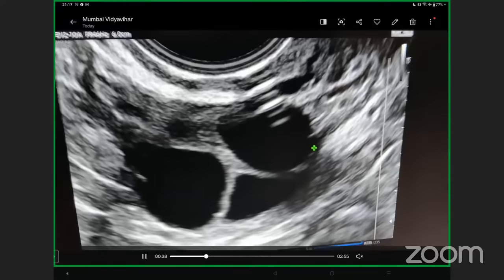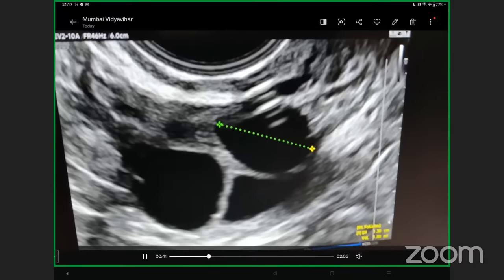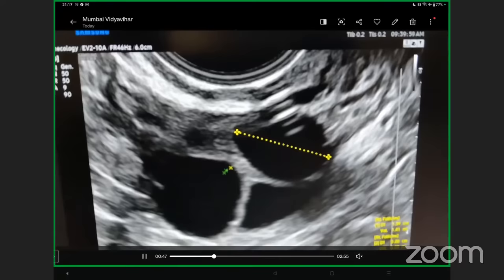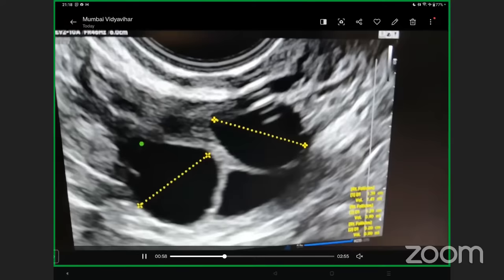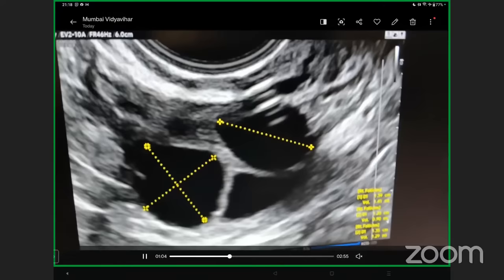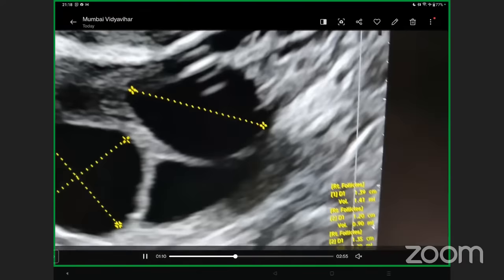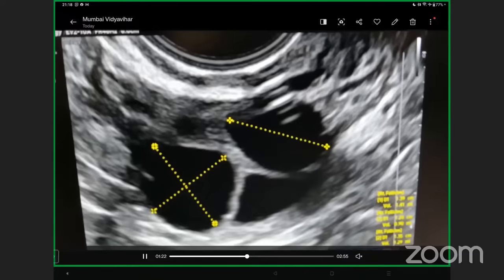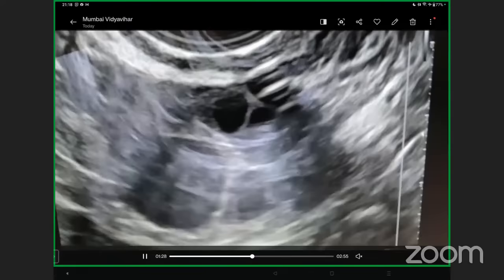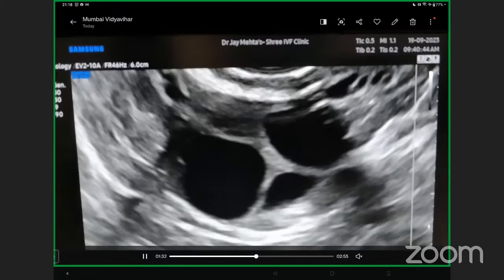This is a day 7 scan. The patient has already taken approximately six injections of HMG and is going to start antagonist from today. Freeze the image. Once frozen, if you want just one measurement, take the largest longitudinal measurement from inside to inside — the largest perpendicular measurement inside to inside. If you prefer three measurements, take all three and find the mean.